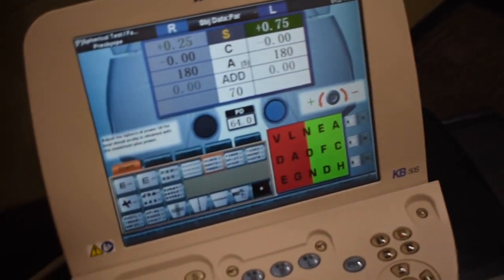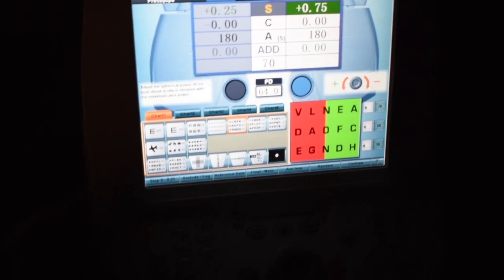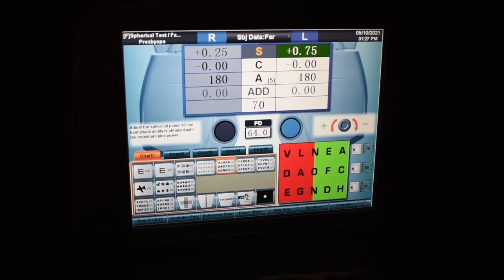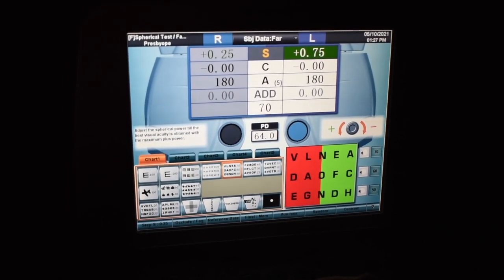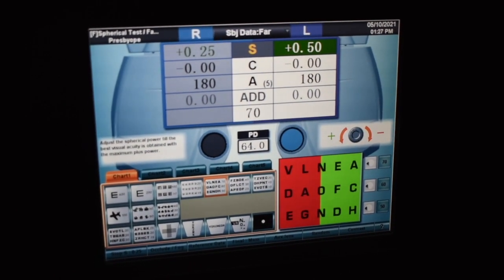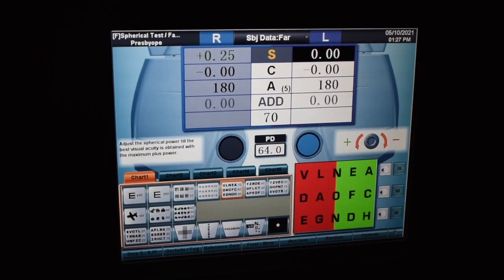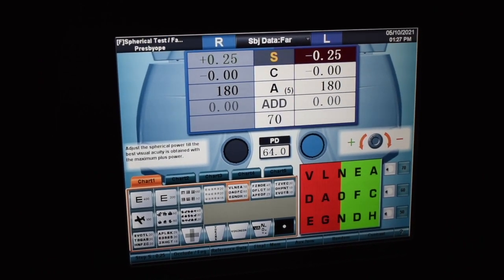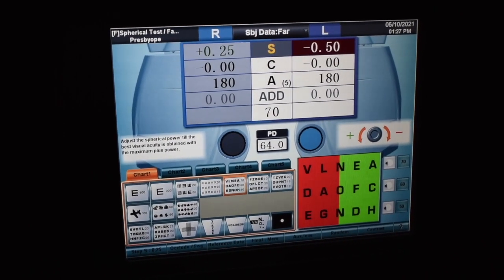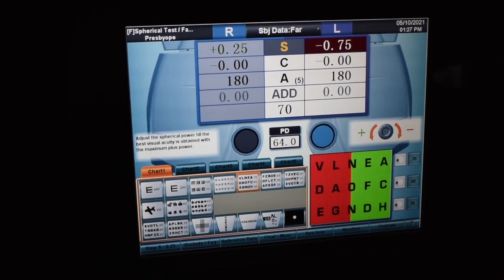For the bichrome, we're going to be turning off the lights. I'm going to be starting with his left eye. Do you see those letters out there? If you were to choose the left, or the red side or the green side, which one seems clearer? The patient responded: red side, red side, red, red, equal, equal, green. So we will leave him on green.